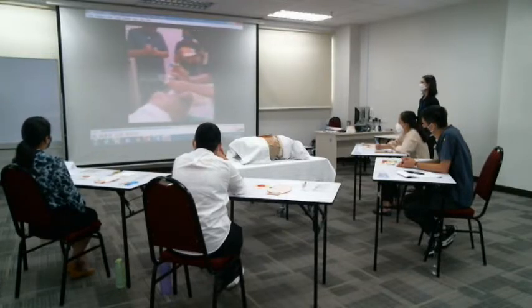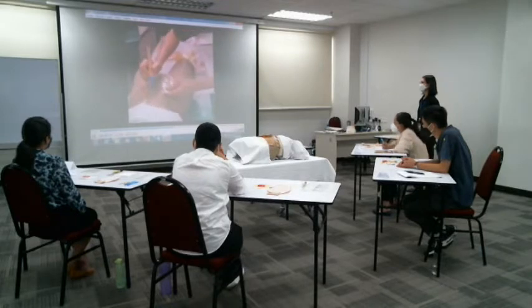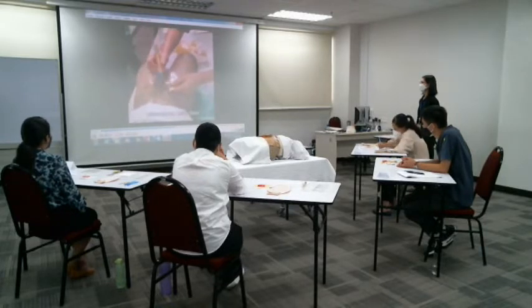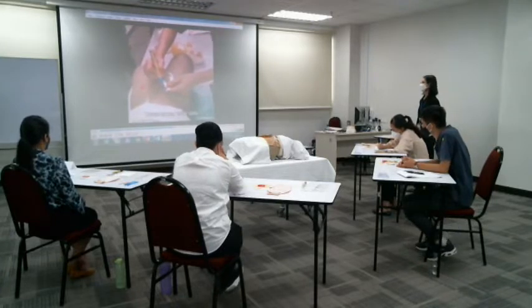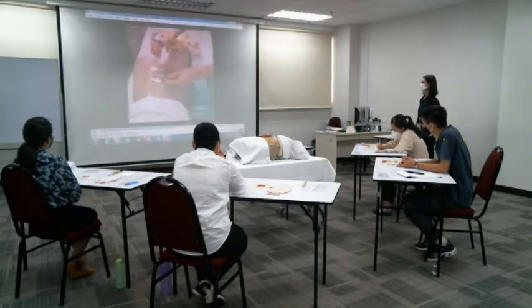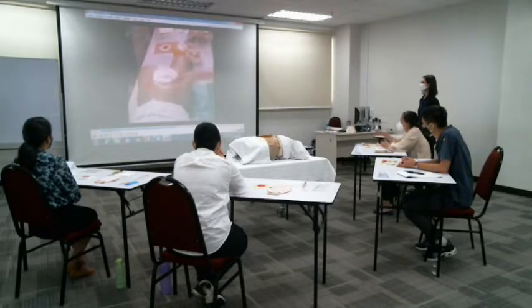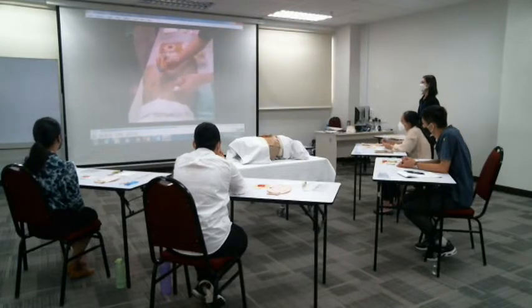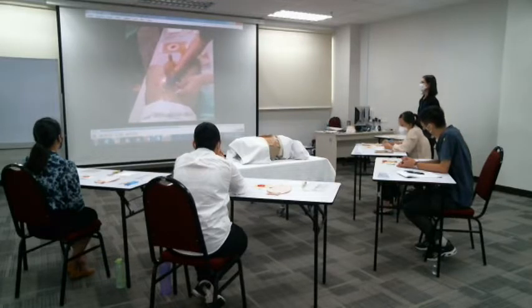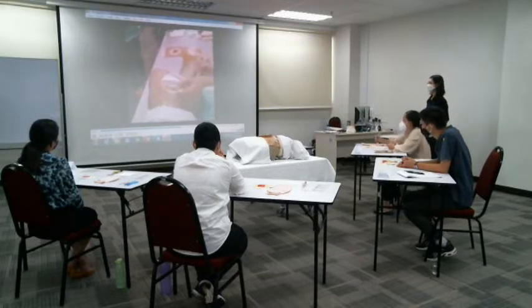And now I'm going to do a measurement. This is the, so the arrow towards the head. So this is 17.6. Why I write it is sometimes in the beginning it swells up and later on it will shrink, become smaller. So I have to take note about the size. Okay? And then after that I start to trace the size of the stoma. Okay? So I trace it.